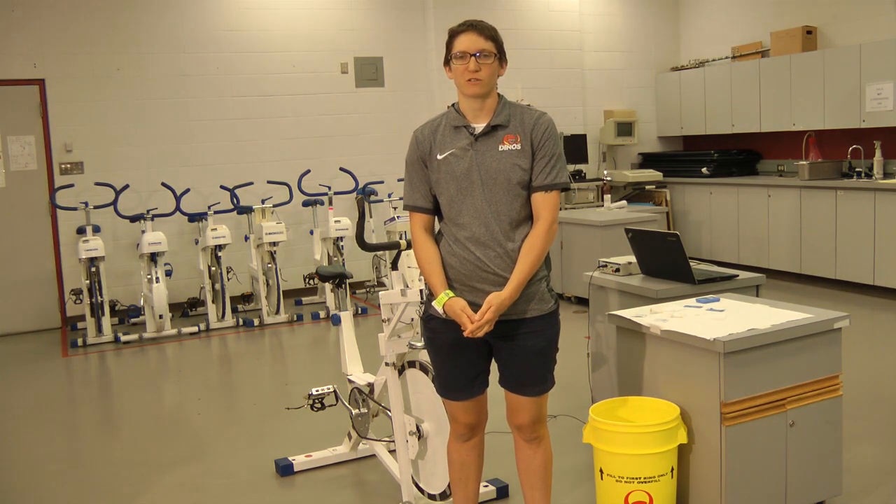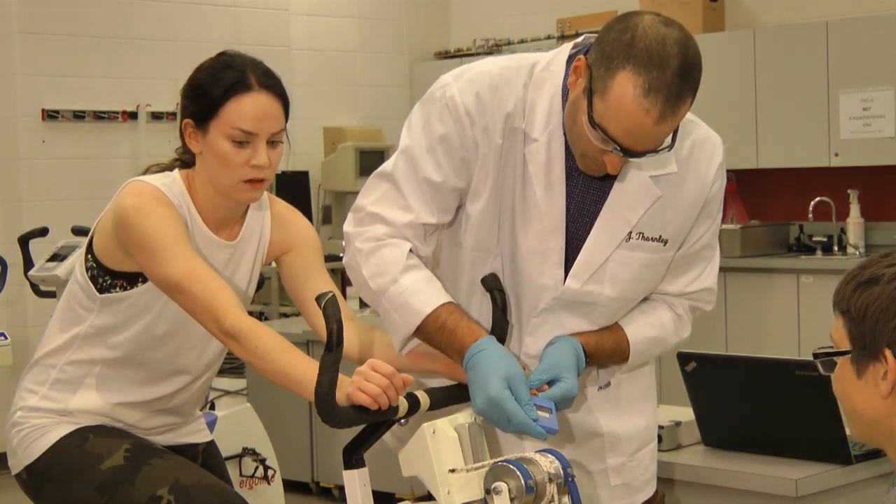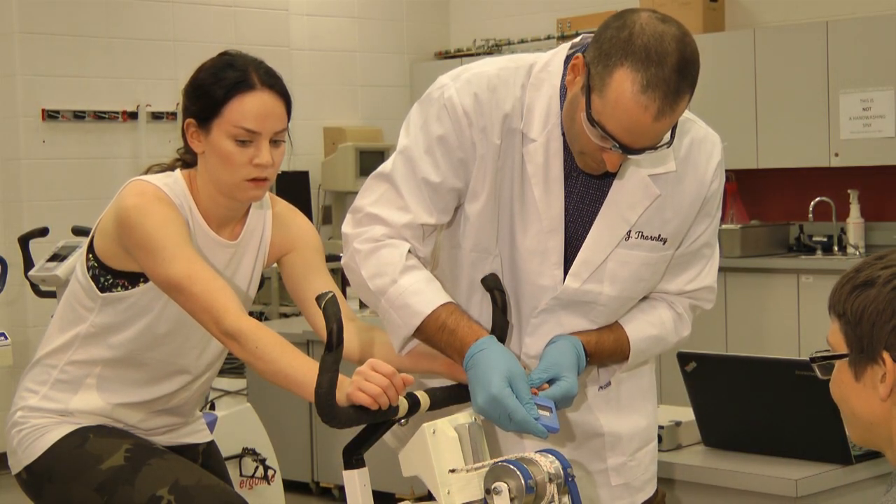Peak power is really important in sports that require a quick all-out effort, such as sprinting, as well as team sports such as hockey, soccer, and basketball. This protocol also involves taking a blood lactate sample at several time points after the test, which gives us extra information about muscle fiber type and recovery.